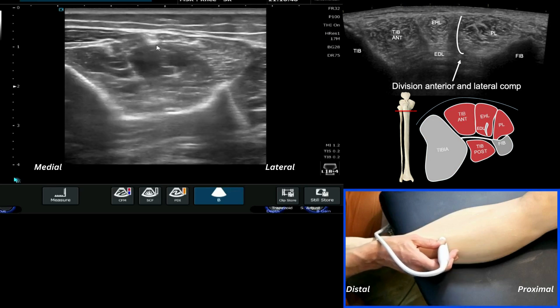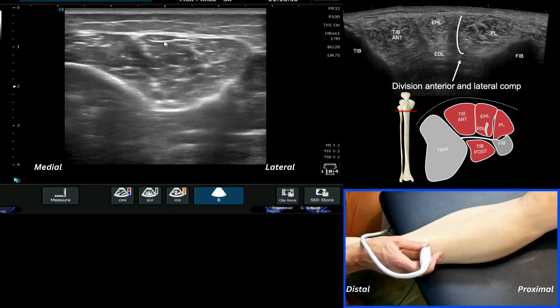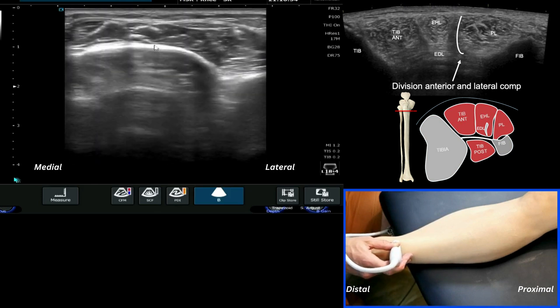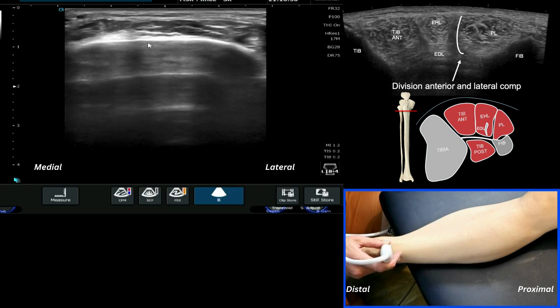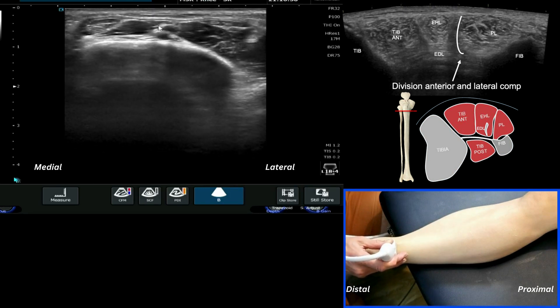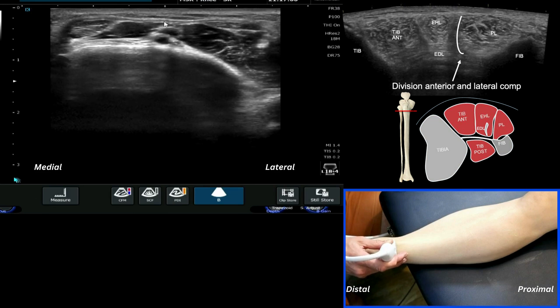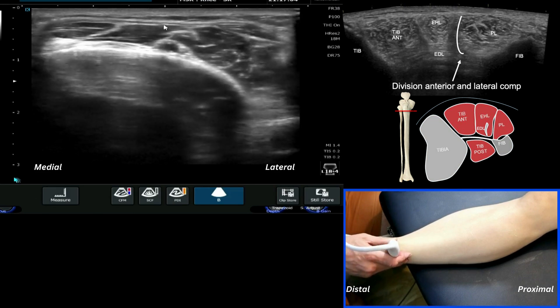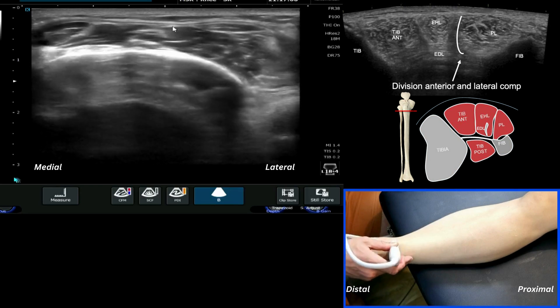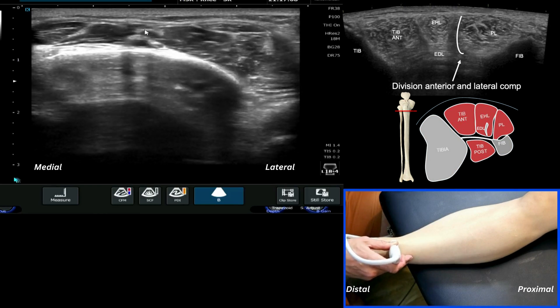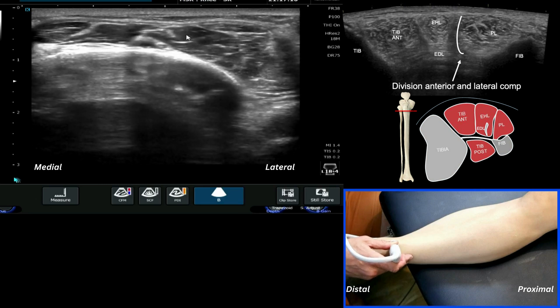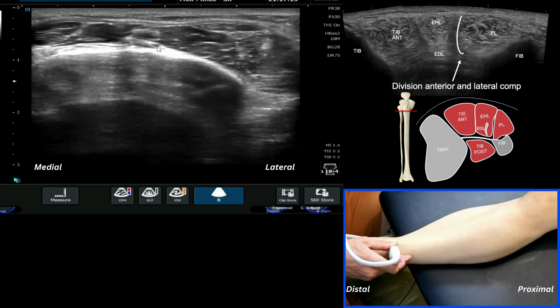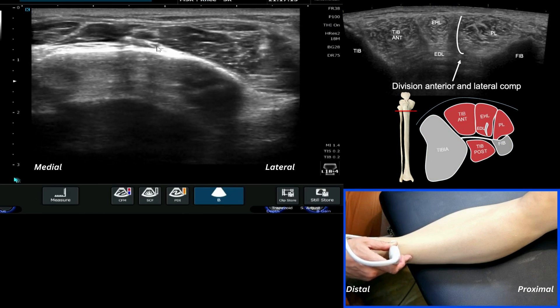Coming a little bit more lateral, we start to see the extensor hallucis longus (EHL) and the extensor digitorum muscle and tendon. If we come down and reduce our depth, it's a bit clearer — this is EHL. If I get the patient to wiggle their big toe, you can see the muscle belly of EHL here. Also visible is the anterior tibial artery, and just adjacent to it, an interesting finding: the deep peroneal nerve.